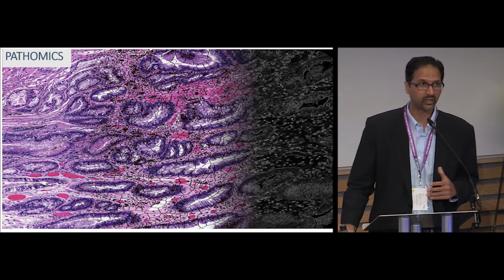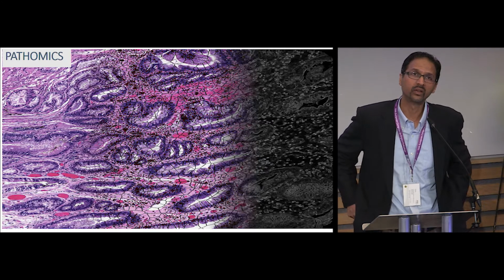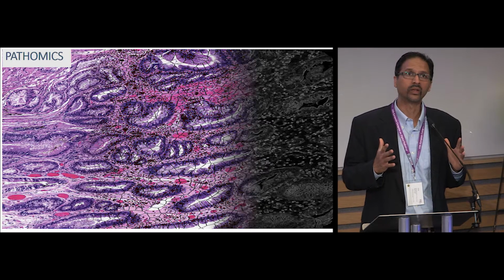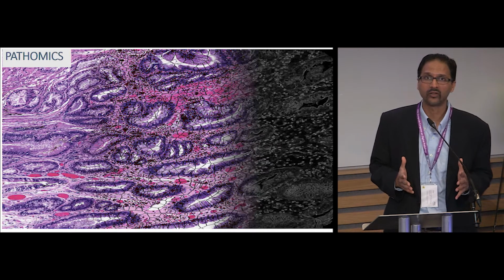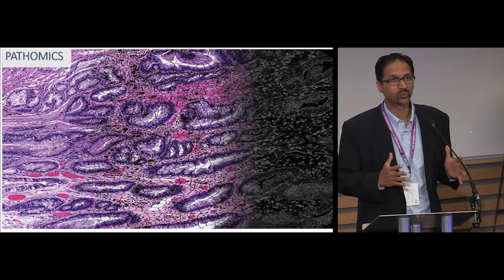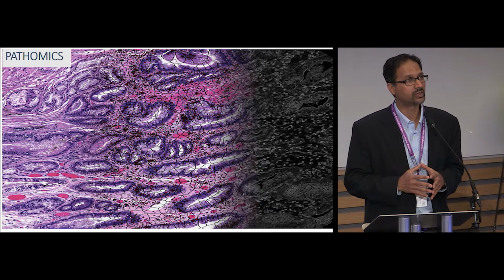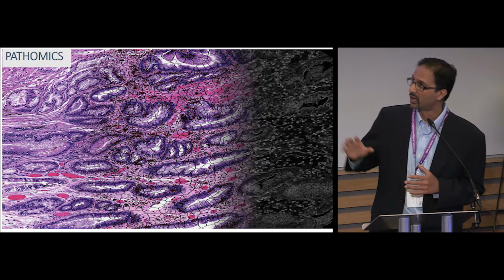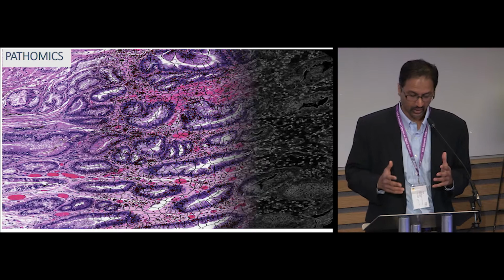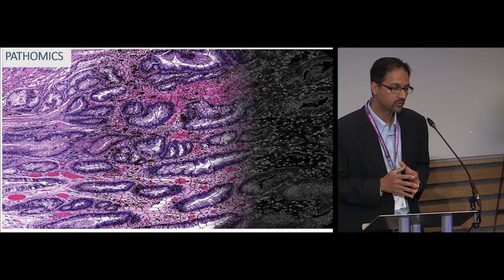And so what you're seeing here, and I'm sure there'll be several slides like this over the course of the 2 days, is that we can now digitize these slides fairly routinely. We can start to apply AI tools to identify individual cells, individual primitives in the pathology slides. We can start to extract features from these various primitives, just showing some of the work that we're doing in our group, where we're looking at the spatial architecture and the spatial arrangement of individual cells.